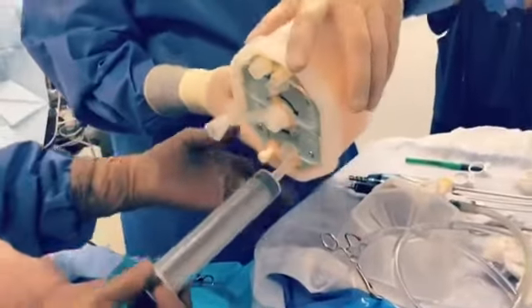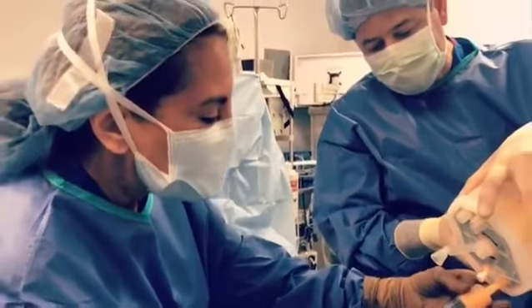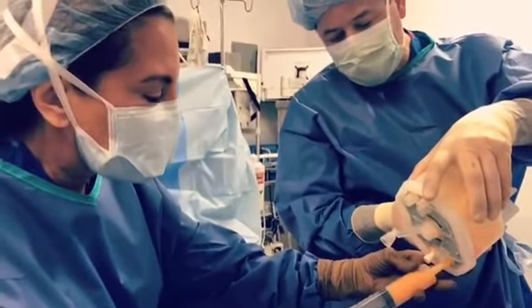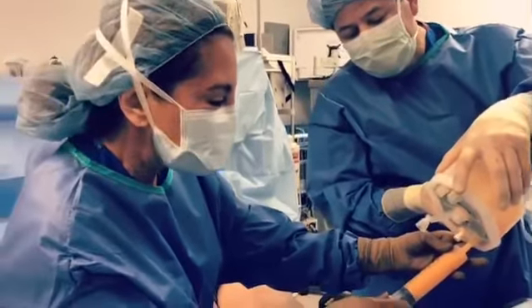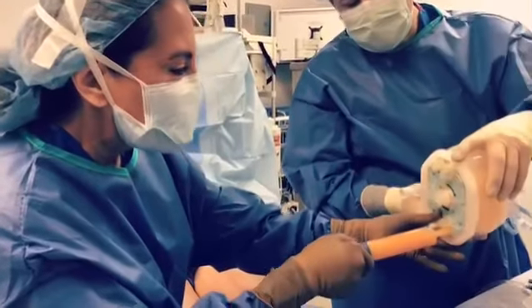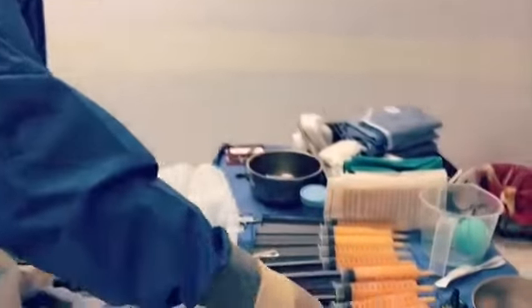This is going to go into areas of liposuction deformity. She had two previous liposuction procedures and has a lot of concavities in the areas of the flanks and hips — the love handle area — too much was taken out. So we're going to restore that area to a beautiful contour. It's going to blend in with her buttock.